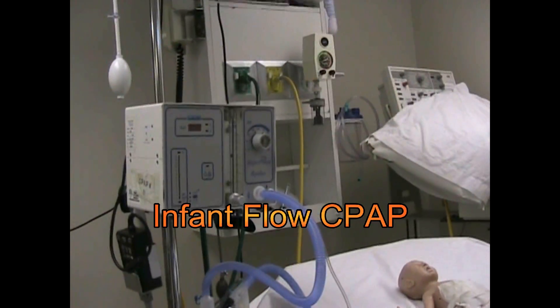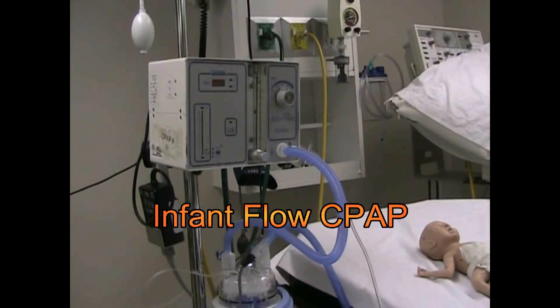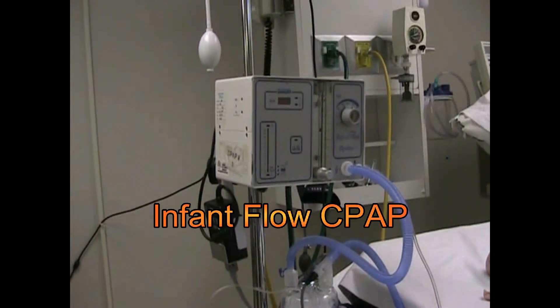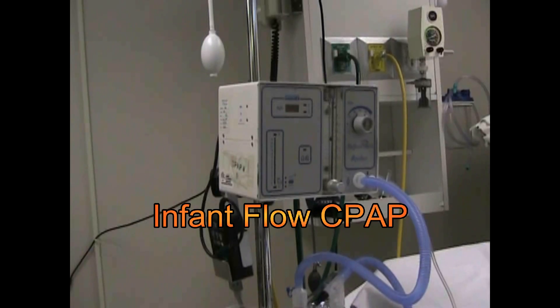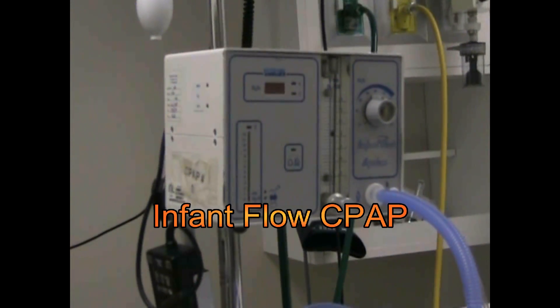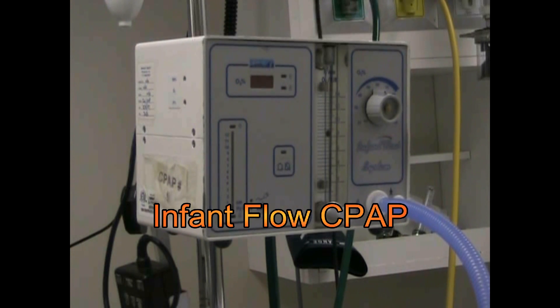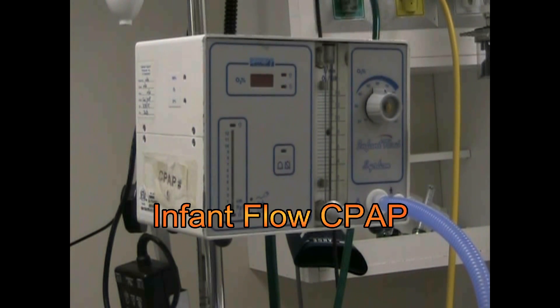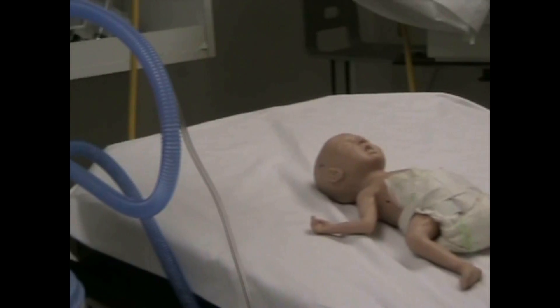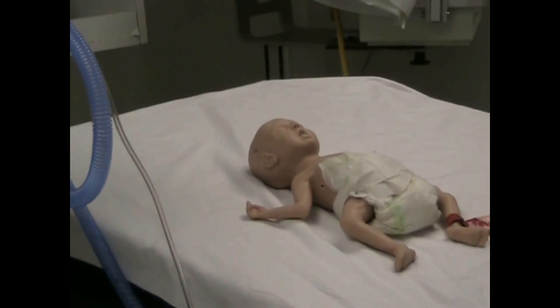Today we're going to be looking at the InfantFlow CPAP system. I'm going to show you how to set up this device and how to ventilate, or at least help hold the alveoli of little infants open. We have our little baby mannequin right there.